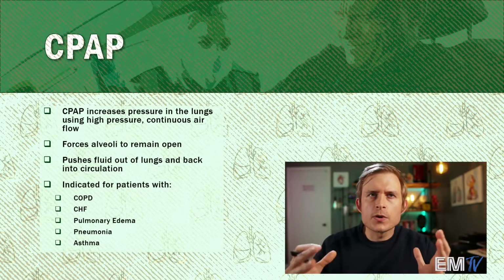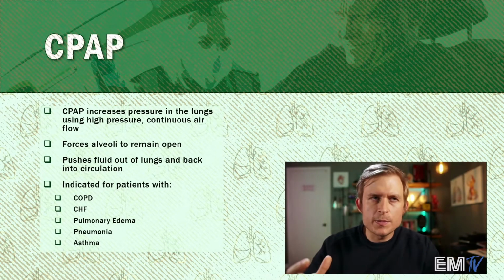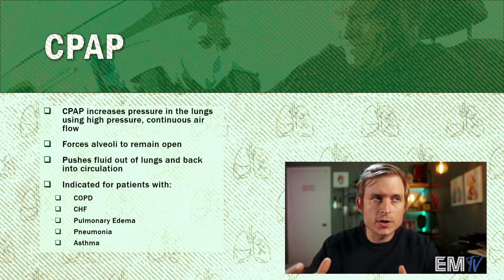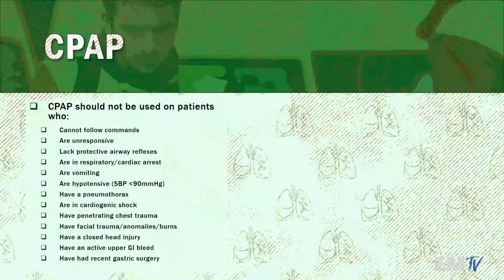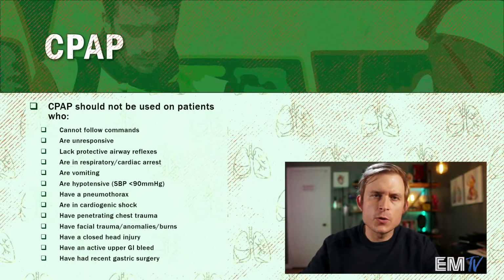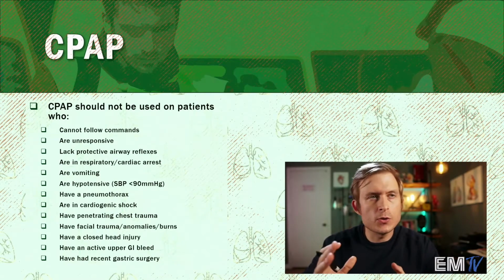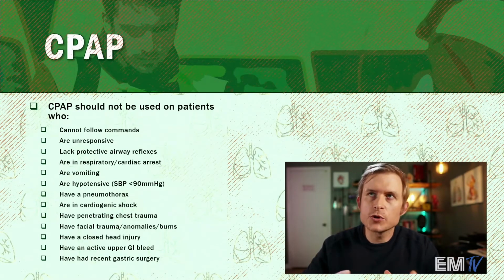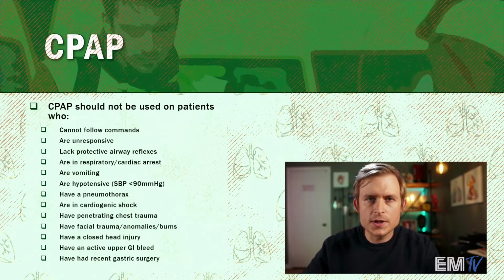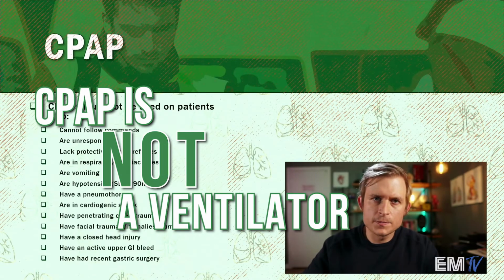But we can use this for a variety of different patients as well. Our COPD patients, CHF patients, patients with pulmonary edema like we talked about, patients with pneumonia, and then patients with asthma. It should be noted, however, that CPAP should not be used or is contraindicated in patients who have the following: patients who cannot follow commands, patients who are unresponsive, patients who lack protective airway reflexes, patients who are in respiratory or cardiac arrest, and this is because CPAP is not a ventilator.